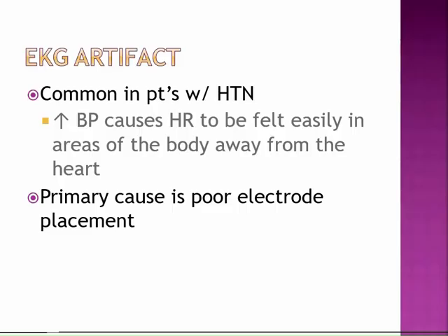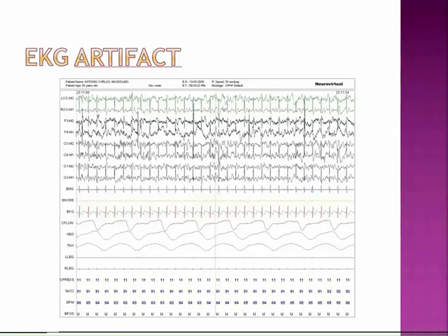And so it's not actually the EKG leads that you need to move. Let's look back here. Oftentimes we think it's EKG artifact, so let's move our EKG channels. That's not the correct answer. What you've got to look at is, in your EEG and EOG channels, the two common electrodes that everything is referenced to. That's your M1, M2. When you have EKG artifact in these channels, your eyes and your EEG, it's usually because of poor electrode placement of your M1 and M2.